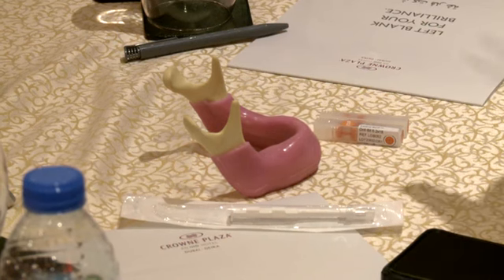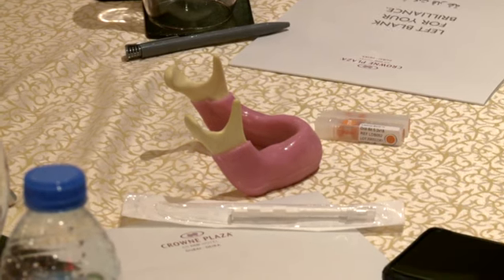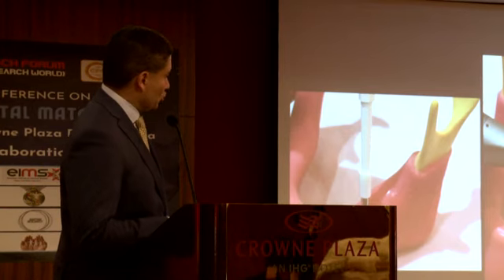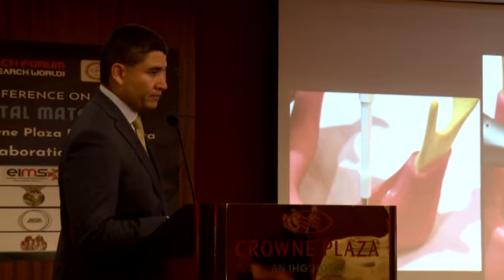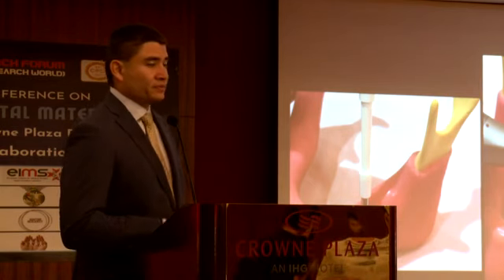If you have a type 1 only, you can just elevate your sequence to a different type of drill. Simple process. You punch the gum. Once you punch the gum, you drill a hole. Now, I want you to try different settings, okay?